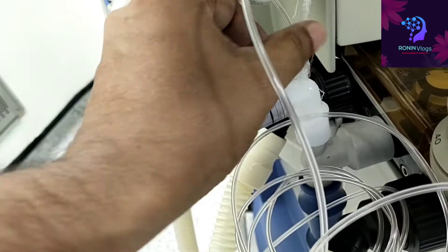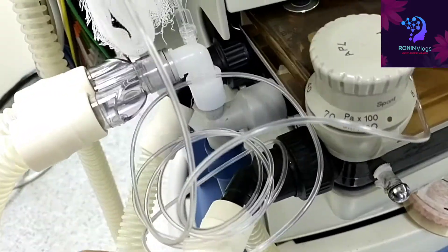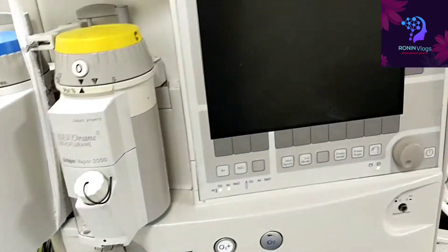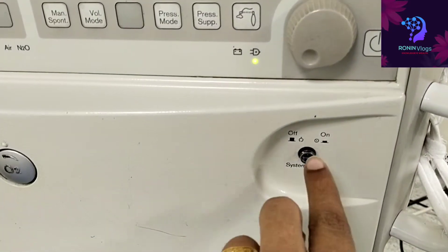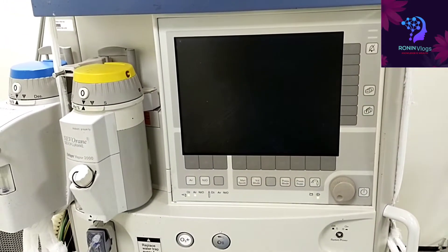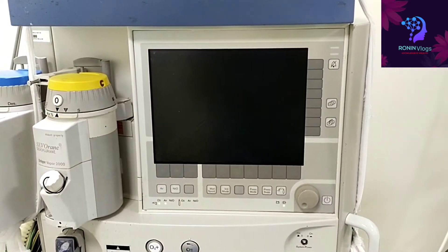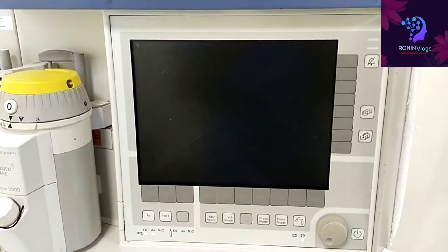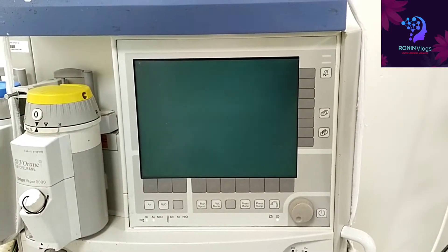Now we need to switch on the machine. This is the main power supply, just switch it on. Daily we need to do the self-test, then only we can know if there are any defects. Anything in the self-test, we can easily find out the issues.